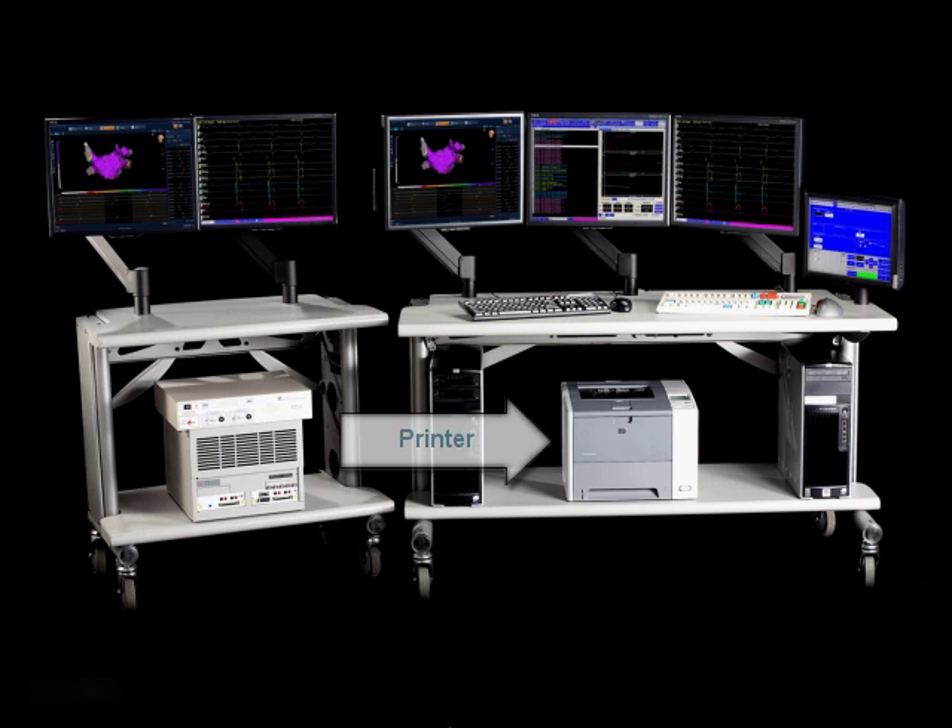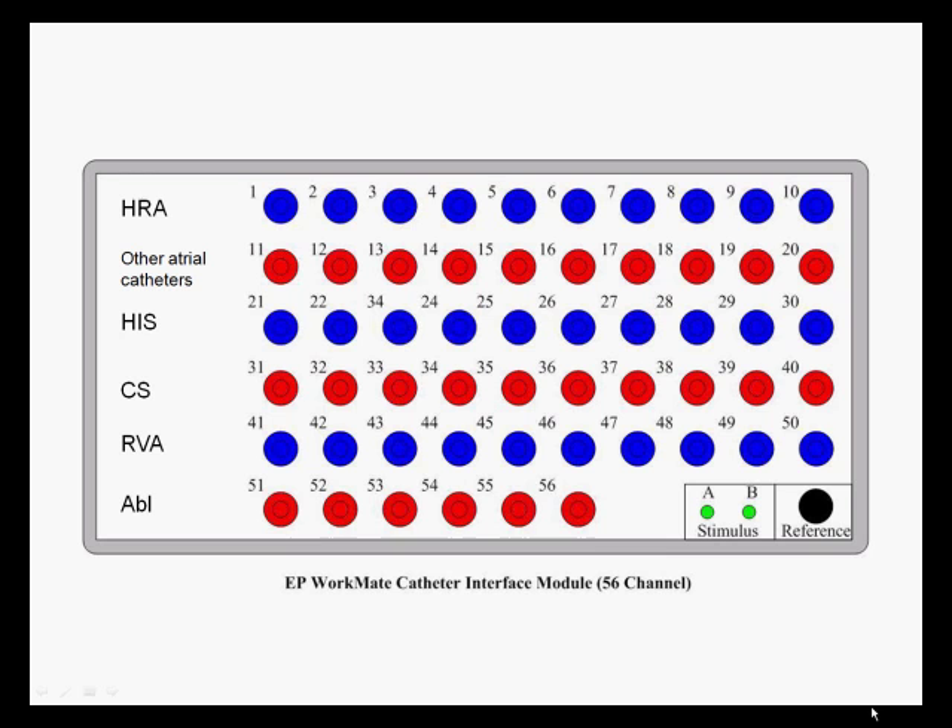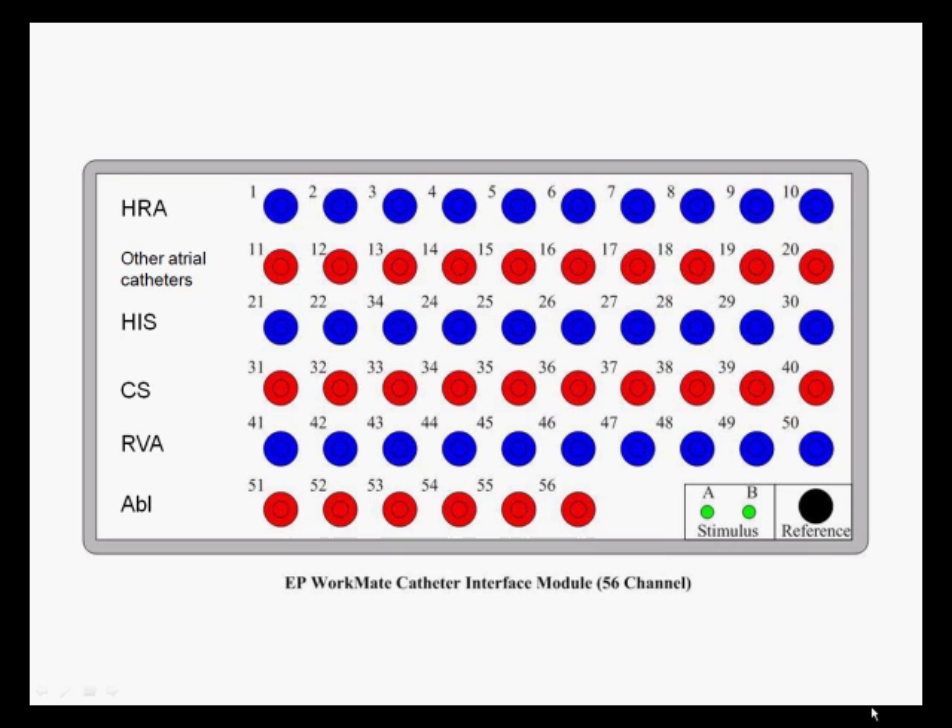There is a printer for printing out intracardiac electrograms, surface ECGs, and reports. Each system also comes with an isolation transformer for electrically isolating the system and conditioning the power. And finally, the catheter interface modules which connect the EP catheters to the EP Workmate Recording System.